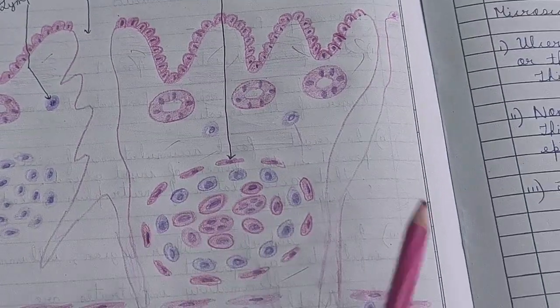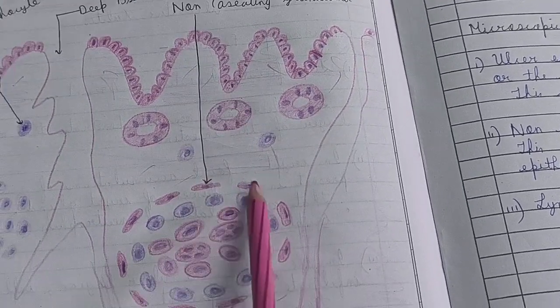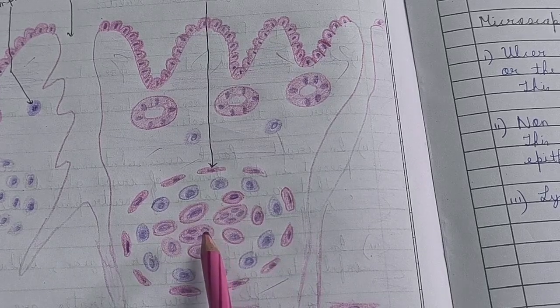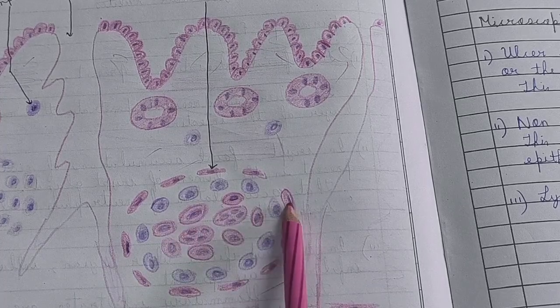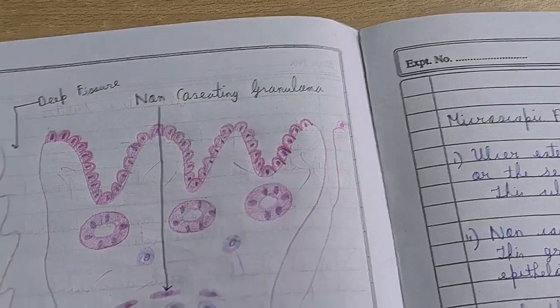Now again see that a non-caseating granuloma is also found. The components are modified epithelioid cells, giant cells, lymphocytes, and plasma cells. They together form the non-caseating granuloma.